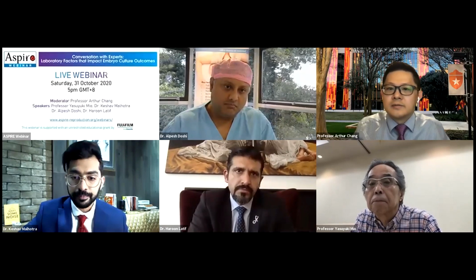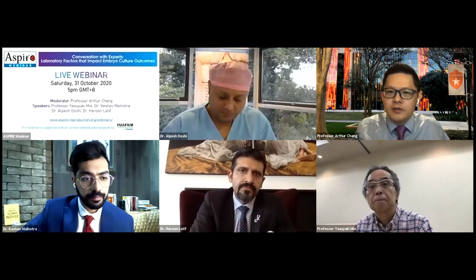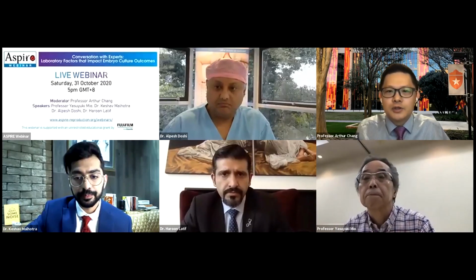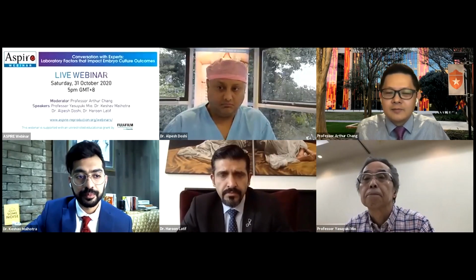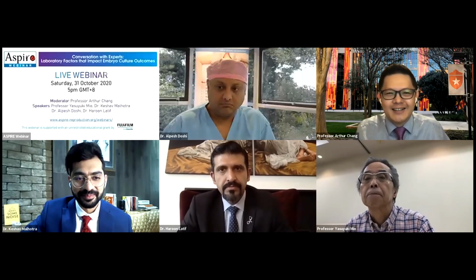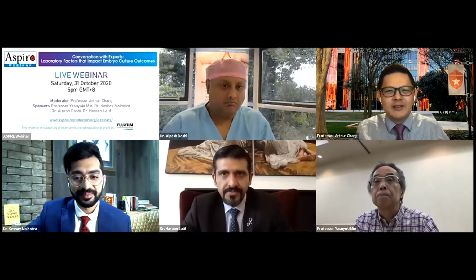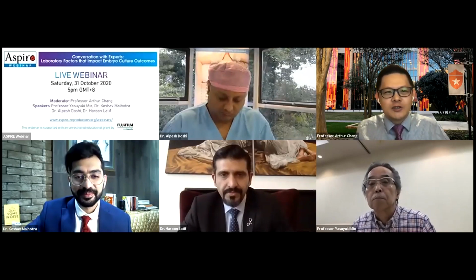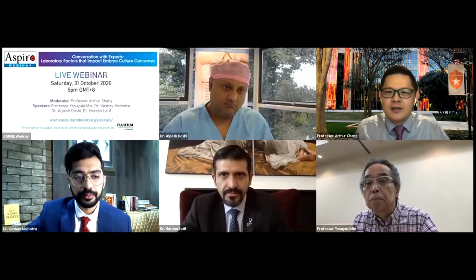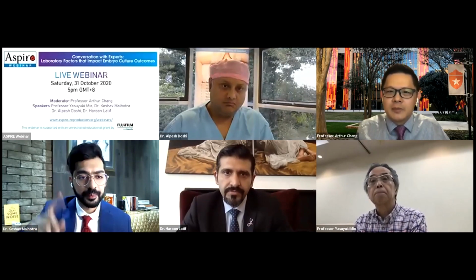Thank you. So also, I would like to emphasize that oftentimes the manufacturer will have the suggested protocol. Yeah, so we should always read the manual. I know sometimes many people just go ahead and don't check the manual, either we use a microwave or in the lab, but follow the manual. And oftentimes the same manufacturer derives a different medium, then they will have a different instruction.